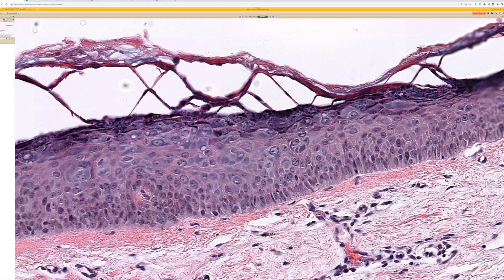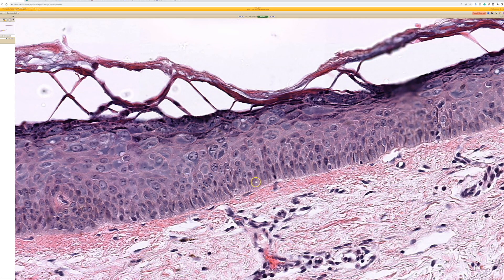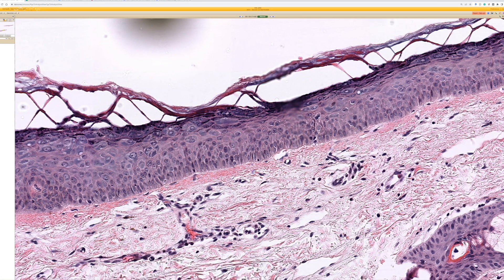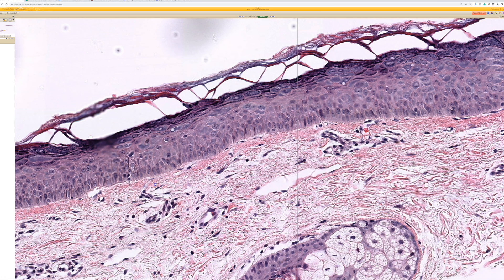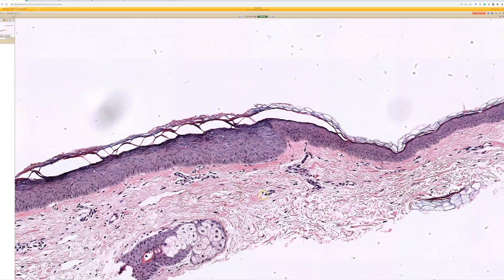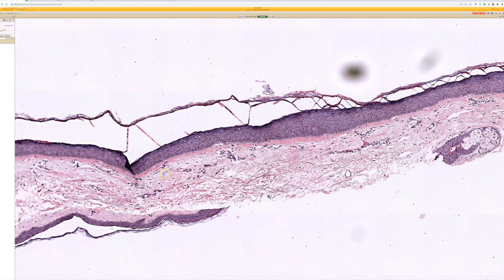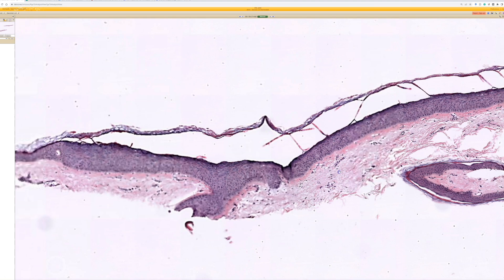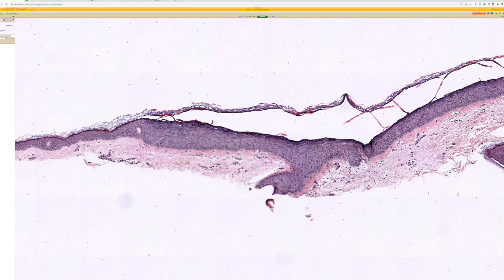Sometimes the little incidental findings in pathology don't matter much most of the time, but they matter when you notice something and it makes you worry about something more nefarious. That's why it's good to know what all these little focal incidental findings are — plus it's one of the fun things about dermatopathology that adds granular knowledge to our learning. If this lesion was clearly what the dermatologist was biopsying, I would personally call this verruca plana with epidermodysplasia verruciformis features. If the context was uncertain, I would note that if this patient has many flat wart-like lesions over the body, they should get worked up for a genetic abnormality of EVER1 or EVER2.